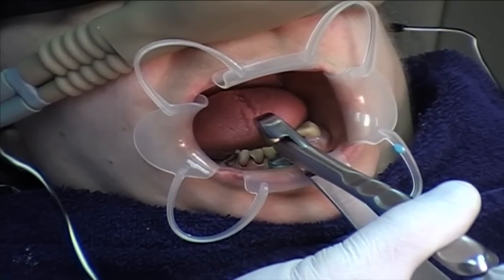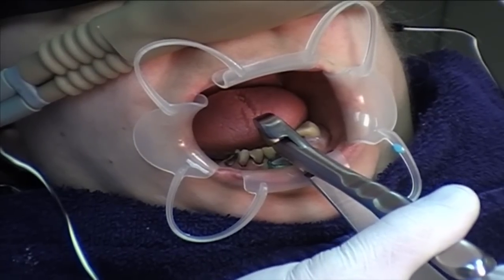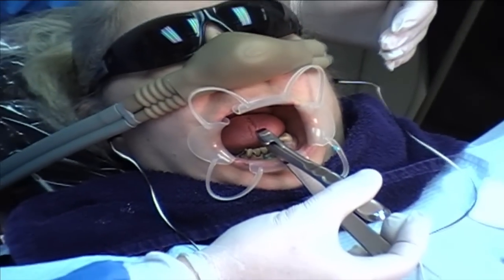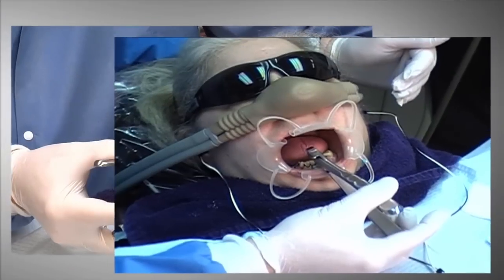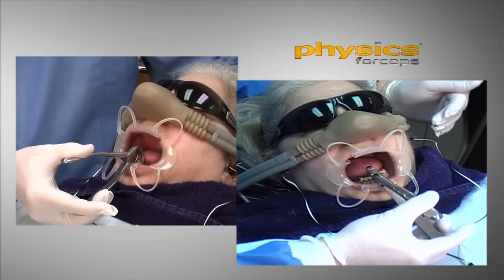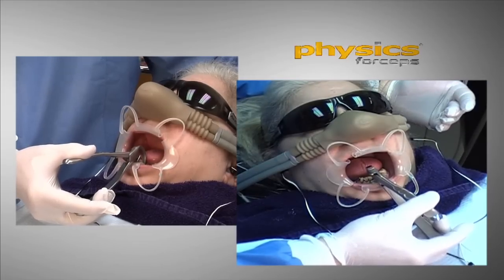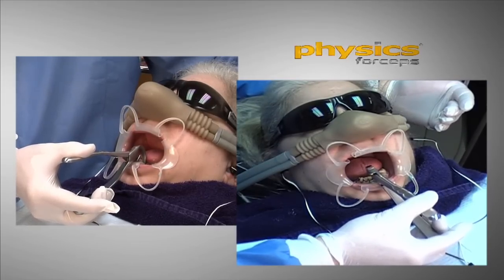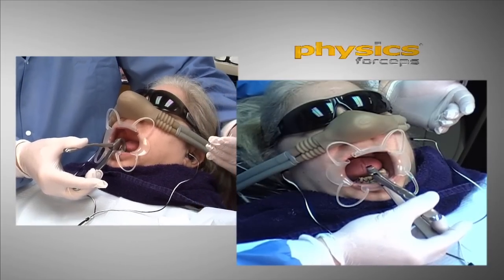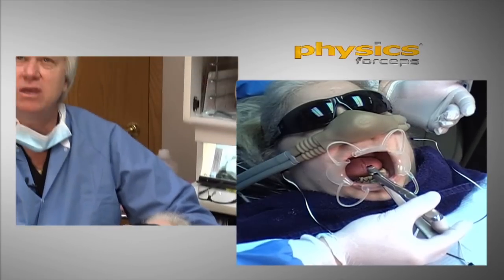And if you could just scan back a little bit, Kristen, that would be wonderful. And just to show my hands and how I'm really holding it with a thumb and one finger. And this is just a leverage finger. And what I'm doing is simply rotating my wrist. No arm pressure at all, no bicep pressure at all. I'm just rotating my wrist towards the facial. Rotating my wrist towards the facial. I'm not using this like a typical forceps, so there's no force here. Okay, you can get back close up there.